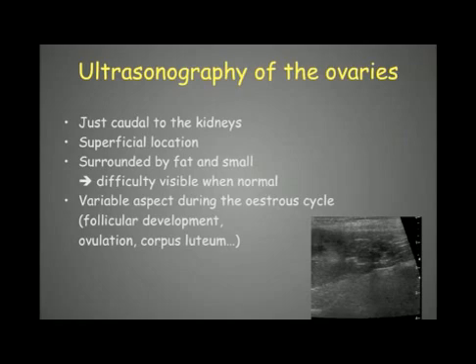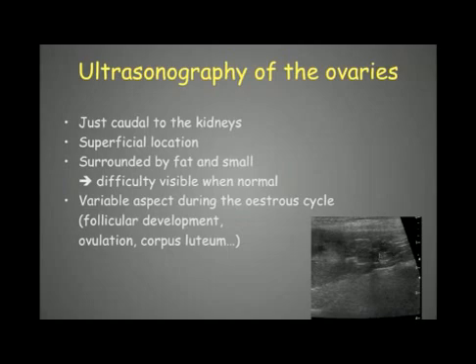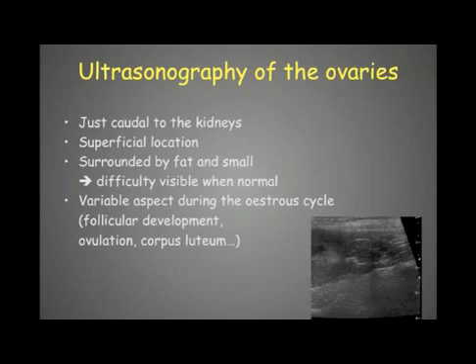Normally the ovaries are located just caudal to the kidneys. As we can see here, this is the left kidney and here is the left ovary. They have quite a superficial location at this level and are surrounded by fat, so they can be quite small and difficult to see with ultrasound when they are normal. They can change in appearance with the estrous cycle: there will be follicular development with anechoic cysts visible within the ovary, then ovulation occurs and the corpus luteum becomes visible, also composed of hypoechoic to anechoic cavities.